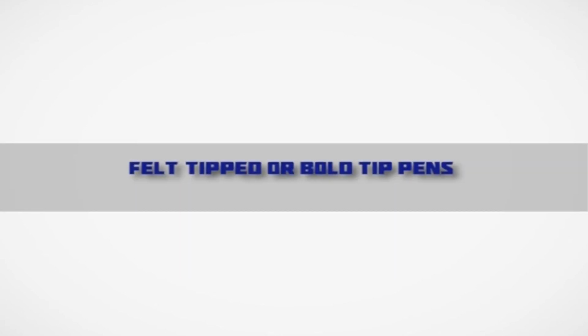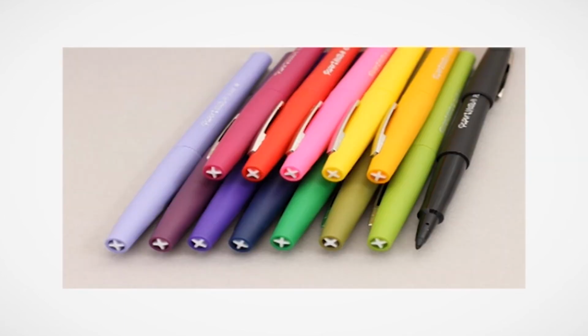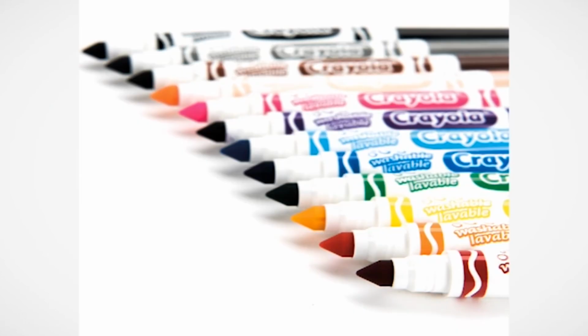Felt tipped or bold tip pens. The larger or bold tip writing pens form larger letters so that a low vision person can read letters and words easily. In order to find the pen that works best for an individual, try experimenting with several different brands and tip thicknesses until you find one that best meets the writing needs.